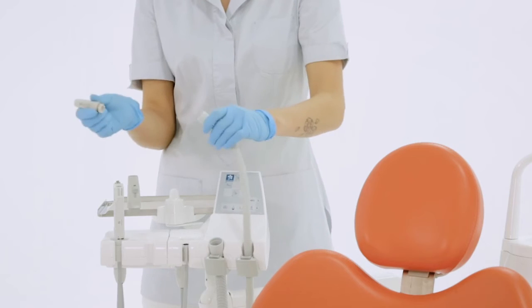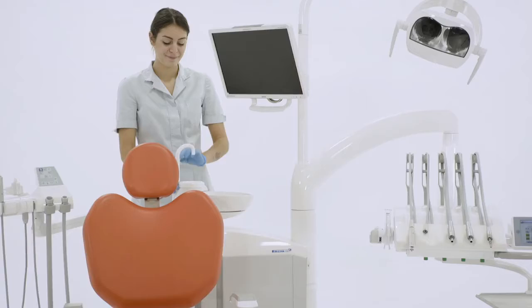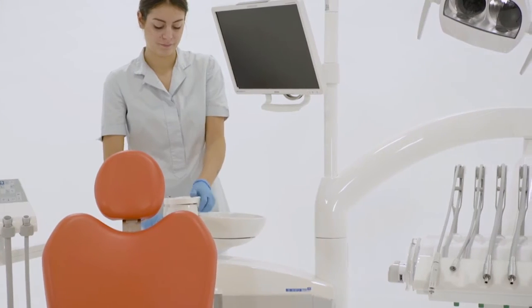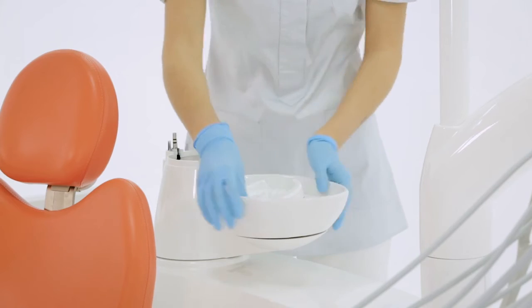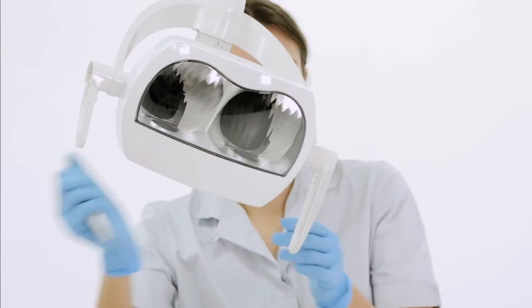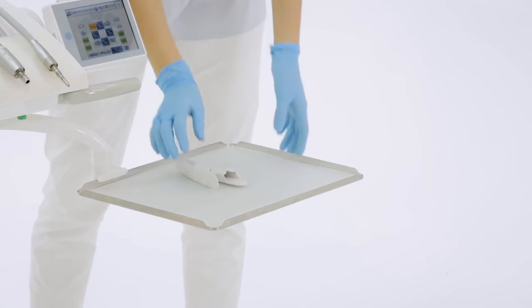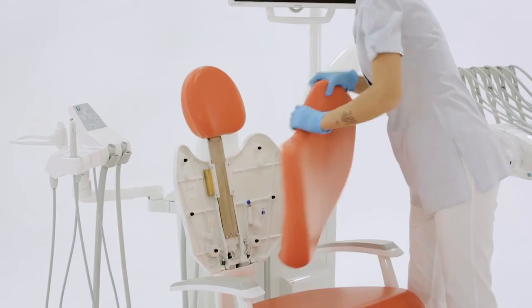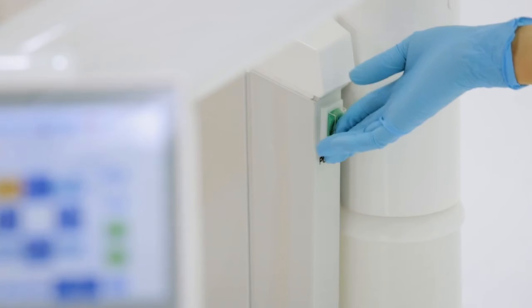Finally, the assistant removes all removable and autoclavable parts of the dental unit to take them to the sterilization area. The dental unit can then be turned off.